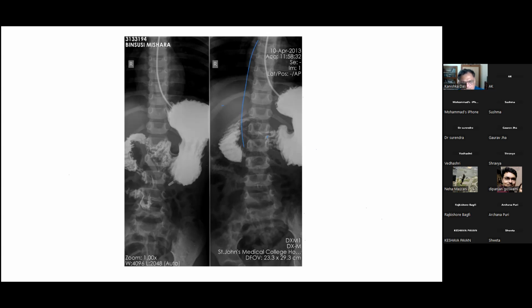That is what will give you the diagnosis. So you turn to the right and you can turn prone, and you see whether it is going down or not. How is this different from a usual upper GI contrast study?